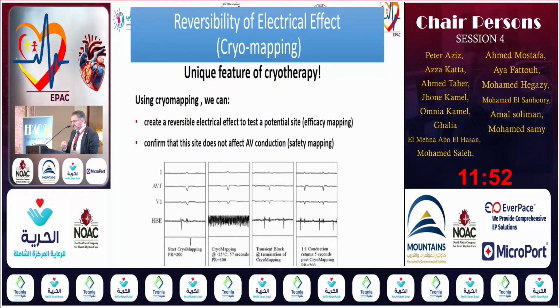One of the most interesting features with cryoablation is the cryomapping feature. So I can exactly test the response to lesion creation in the site I'm touching by first reducing the temperature to around -30. So at that level, the tissue the catheter touches is not functional. So I have an idea about the efficiency of the location, and also I have an idea whether this site is safe or not.